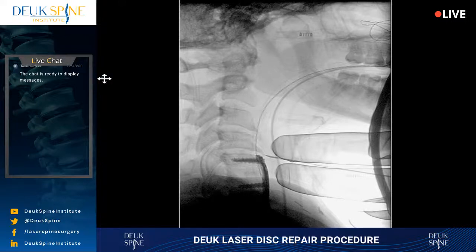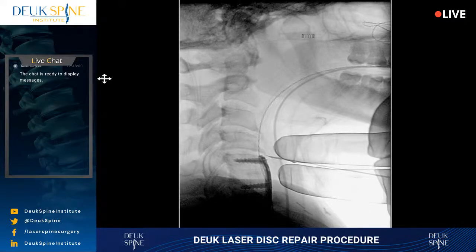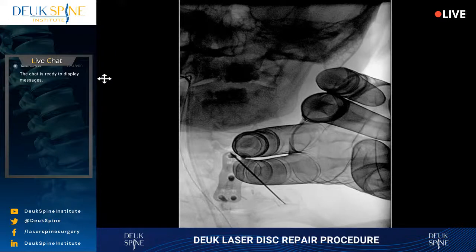And let's get an AP. Go ahead. It's a quick AP. Back to a lateral. The plate's on a little crooked.